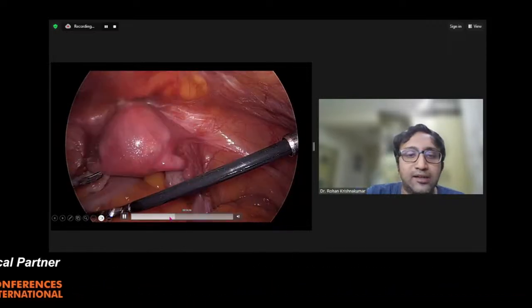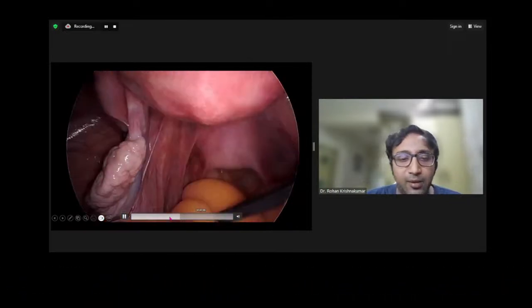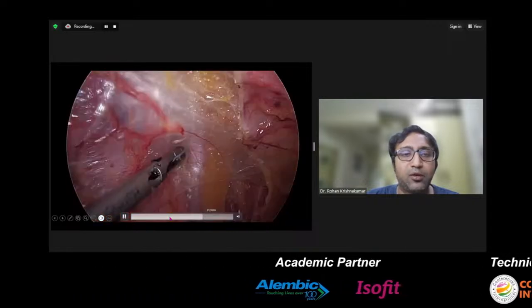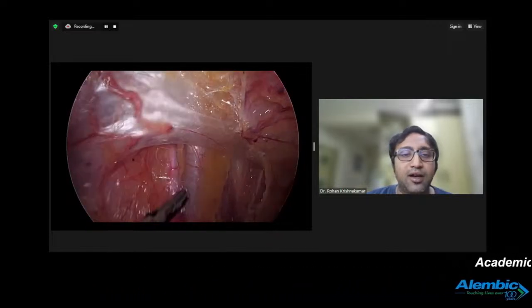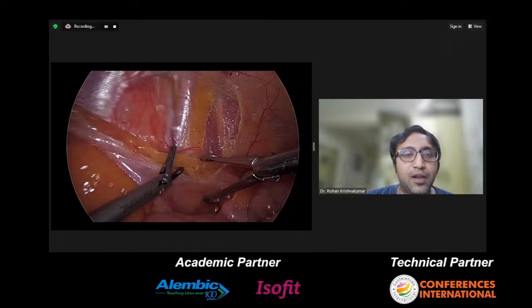And intra-op, you can see these beautiful signals that you get while operating. Many people won't stent it. Even we don't stent it. This was for a trial, but it's very useful for somebody who wants to start off difficult surgery and is scared of retroperitoneal anatomy. So these are simple investments that you can make, which will help make your surgery safer.